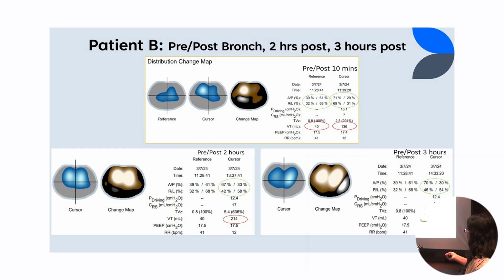Our tidal volume has improved to 214, and then 3 hours, so this is 2 hours later, and then 3 hours later, we're at 237. So being able to track that from that visual aspect.